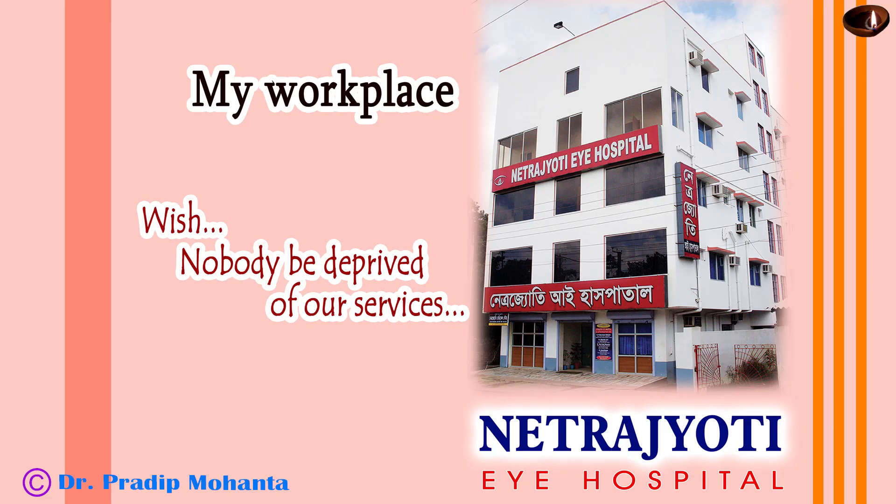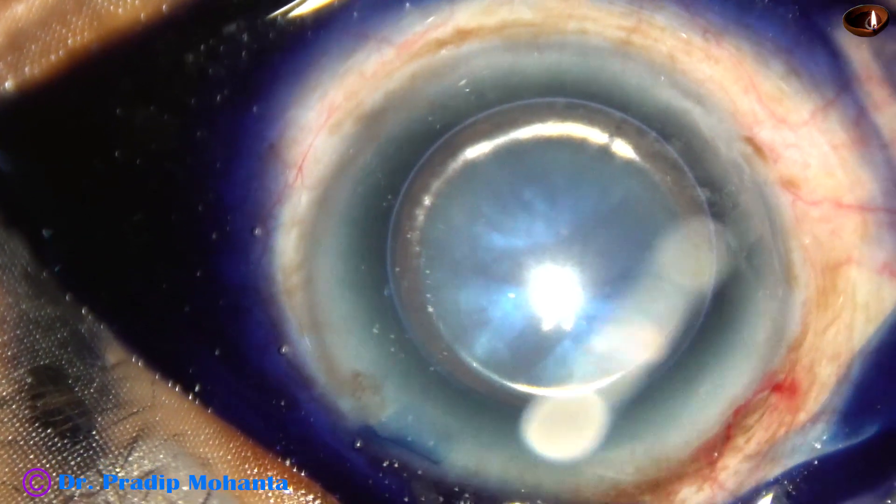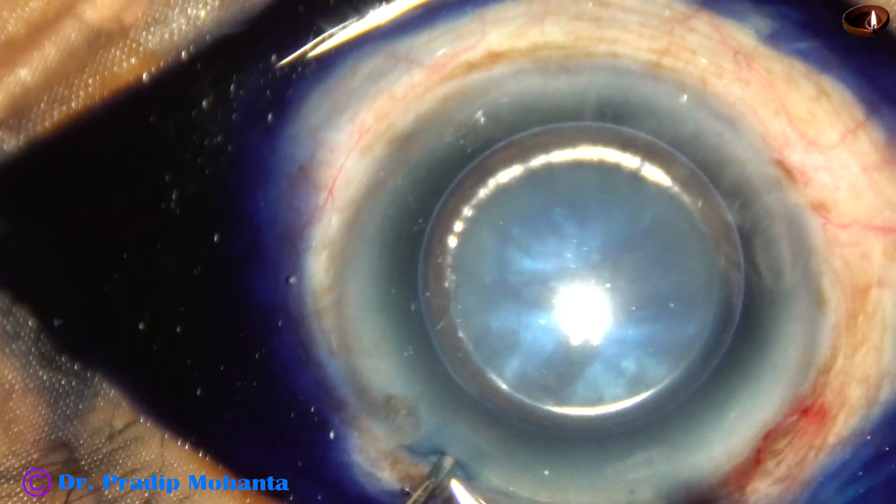Friends, welcome to my workplace at Ranaghat, West Bengal, India. This is an intumescent cataract with very high intra-lenticular pressure.